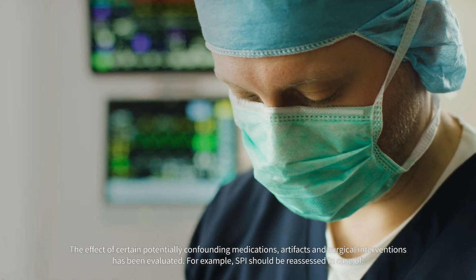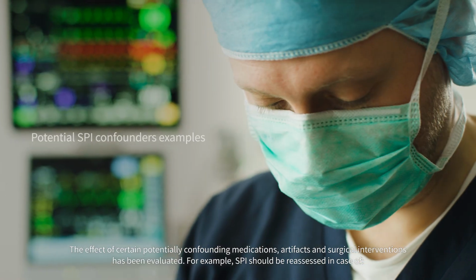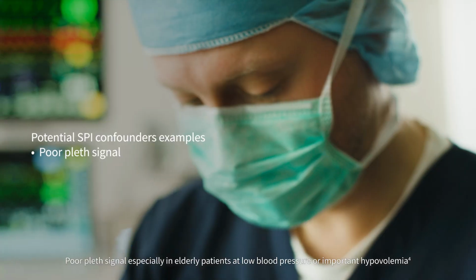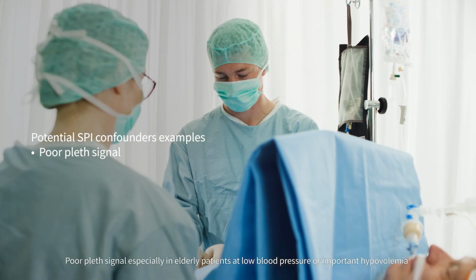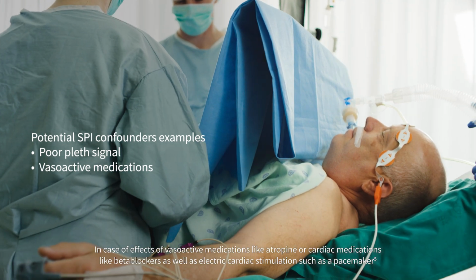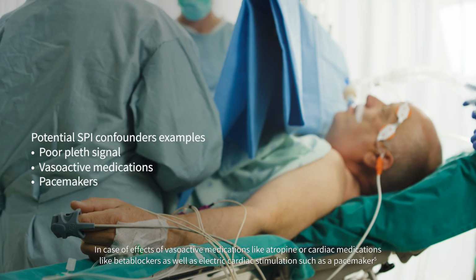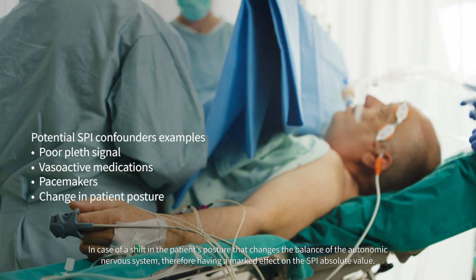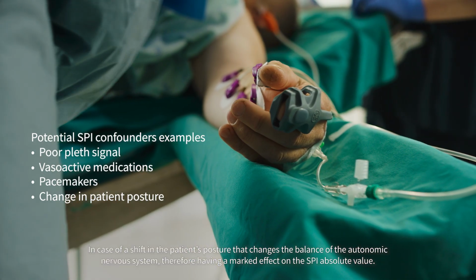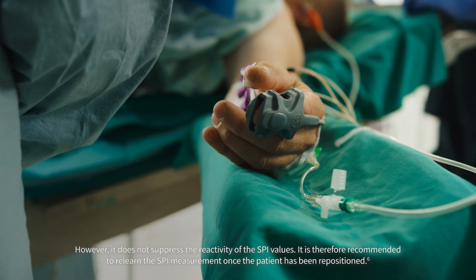The effect of certain potentially confounding medications, artifacts, and surgical interventions has been evaluated. For example, SPI should be reassessed in case of poor pleth signal, especially in elderly patients at low blood pressure or important hypovolemia. In case of effects of vasoactive medications like atropine, or cardiac medications like beta blockers, as well as electric cardiac stimulation such as a pacemaker. In case of a shift in the patient's posture that changes the balance of the autonomic nervous system, therefore having a marked effect on the SPI absolute value. However, it does not suppress the reactivity of the SPI values.